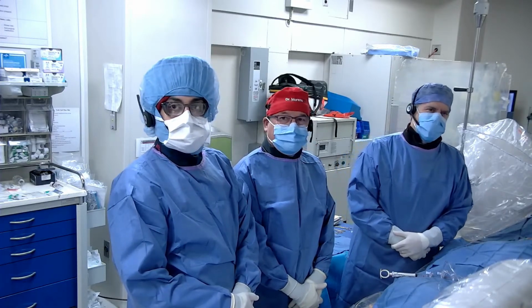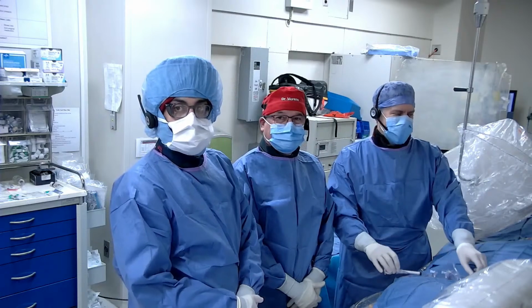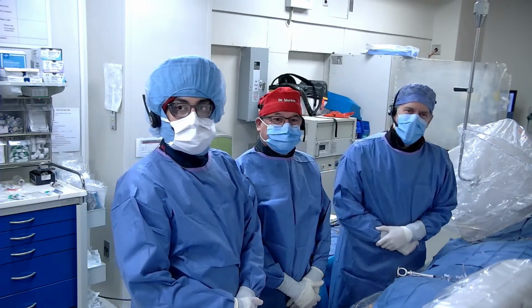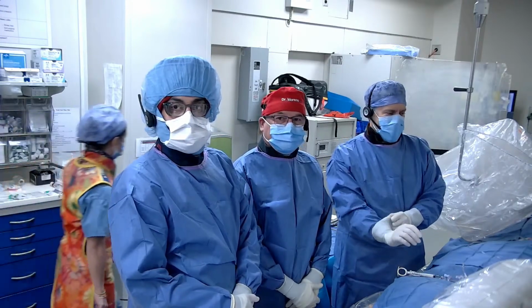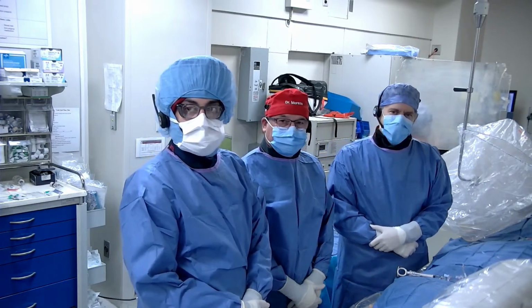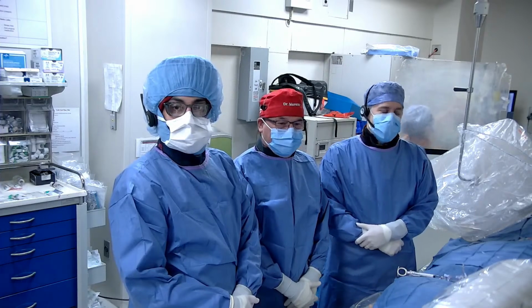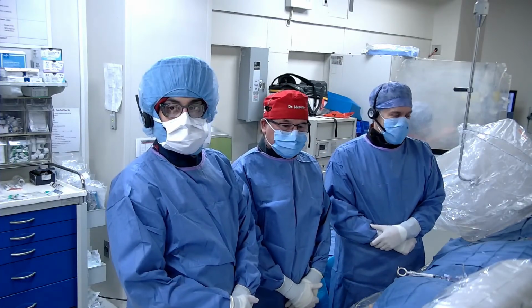Good morning and welcome to Mount Sinai Cath Lab in what is our inaugural case of coronary function testing. This is our first live case for this specific application. And the goals today are really to help provide and spread education into this rapidly evolving field and area, and really review and discuss some of the procedural aspects of performing this in the cath lab.